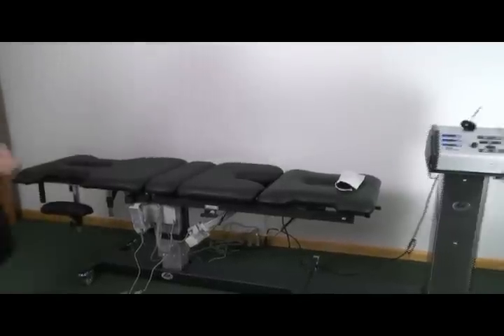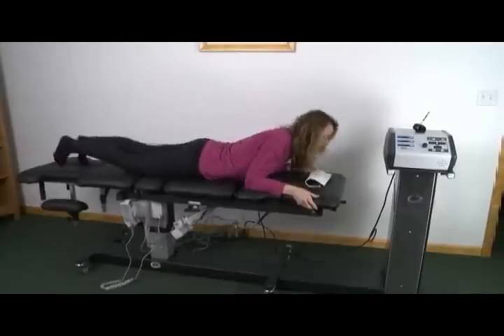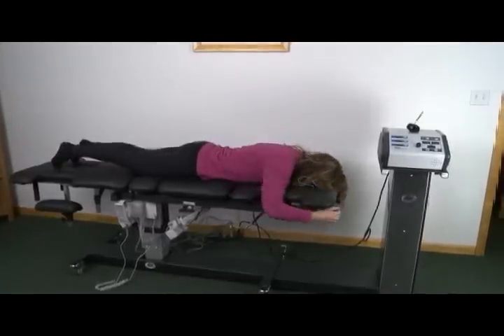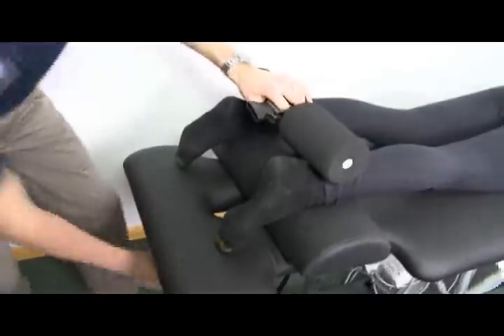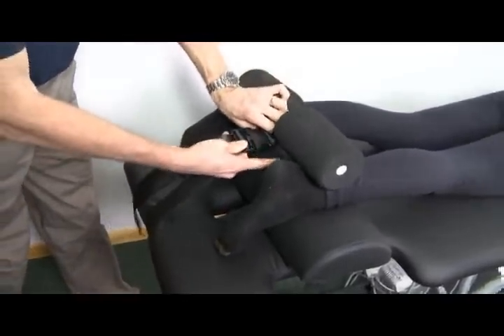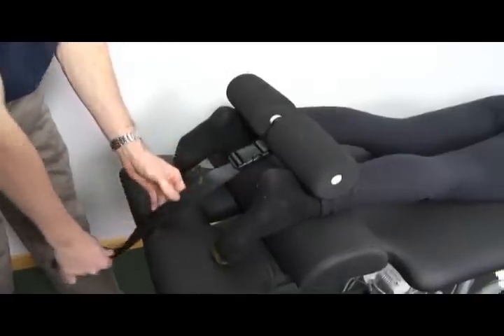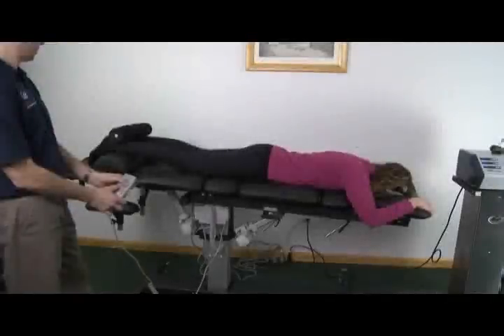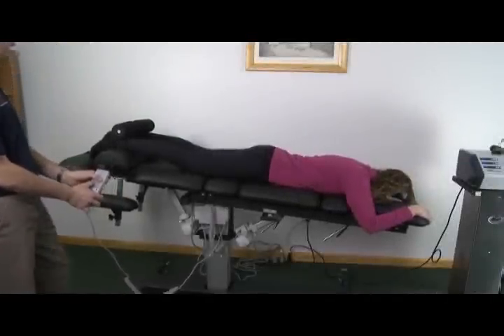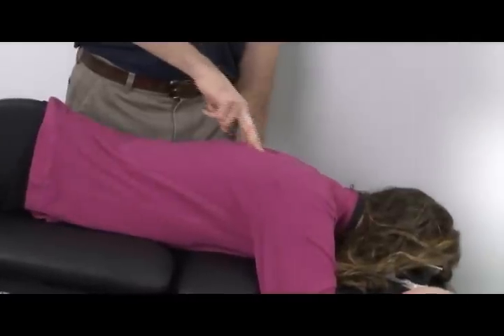To position the patient for prone inversion applications including unloaded instrument adjusting, have the patient lay on the table as shown with their head closest to the decompression drive. Position the ankle restraint as shown at the Achilles tendon area and gently tighten the restraint. Utilize the hand controller and invert the patient as necessary, and begin your adjustment after allowing time for the spine to unload.